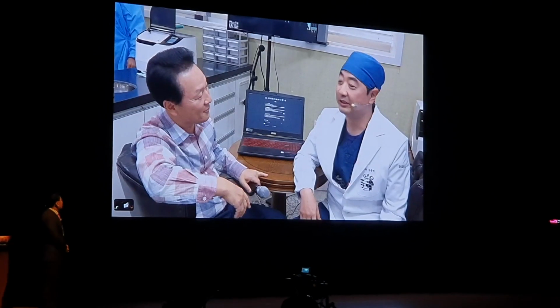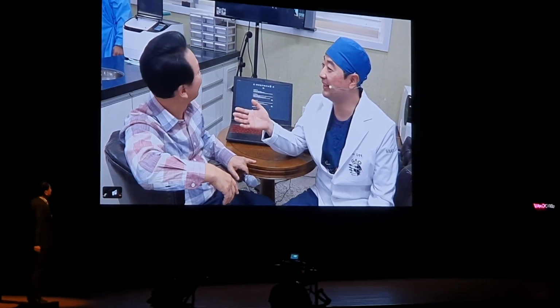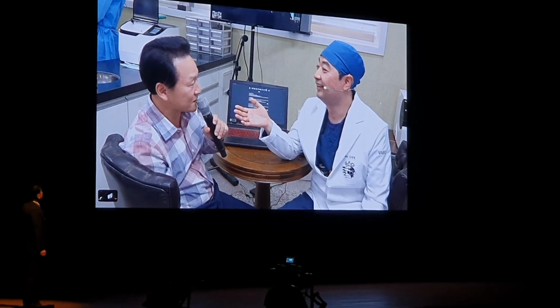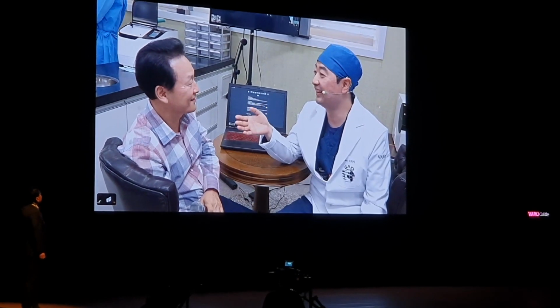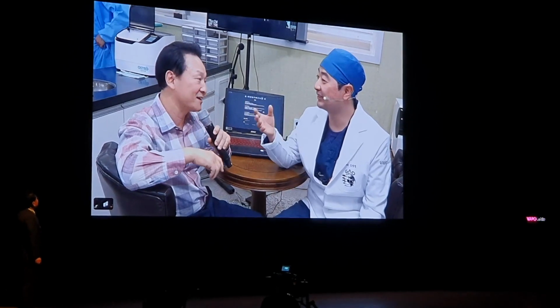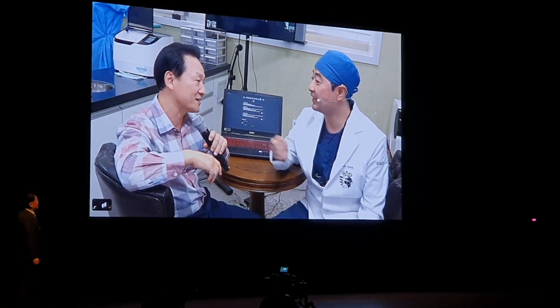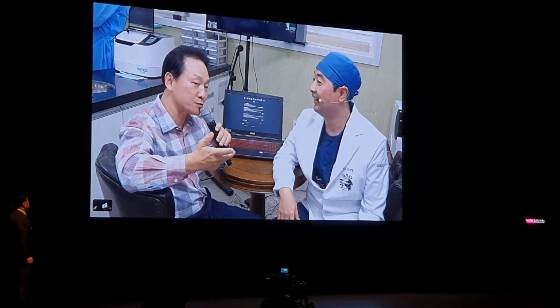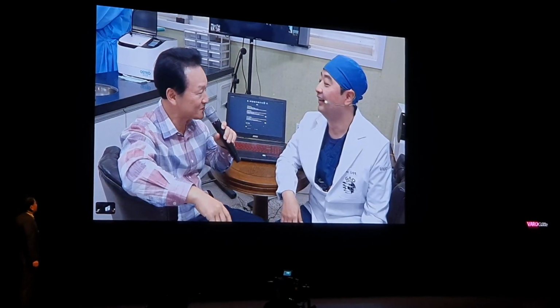Self-implant placement? So you have great experience in placing implants, but you've never done it yourself. Absolutely. Yes, that is correct. Well, I think it's best that I do the surgery and you check the process. Well, but the audience won't have much fun in it.